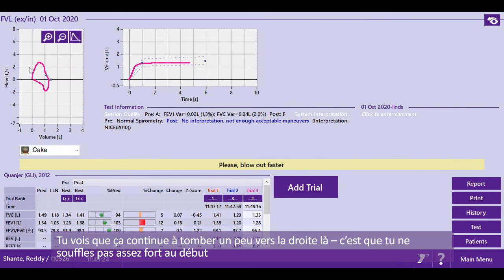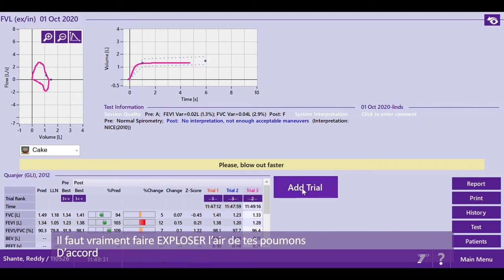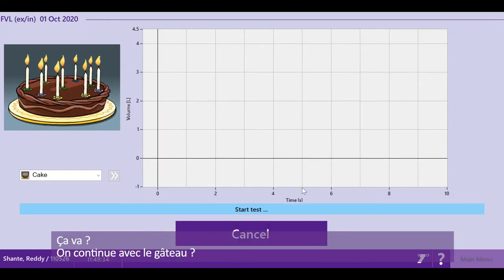You see how it's falling a little bit to the right like that? Not blowing fast enough in the beginning. You've got to literally blast the air out of your lungs. Okay. You feeling okay? Yes. You like the cake still? Yes. Good.